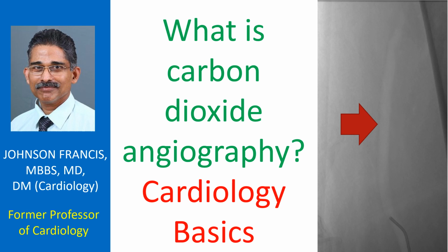But usual iodinated radiocontrast dyes have a potential risk of causing acute kidney injury. This is more so in those with already impaired renal function. It is in this situation that carbon dioxide angiography is usually considered.